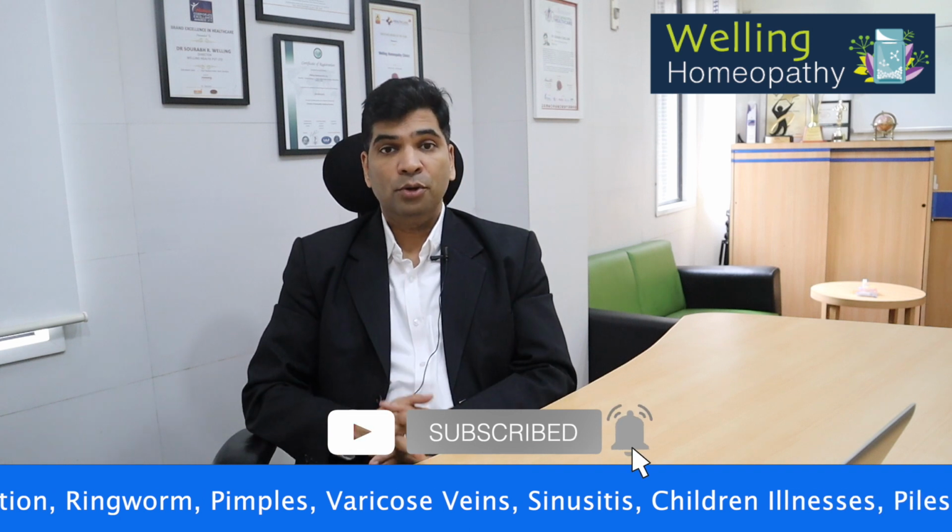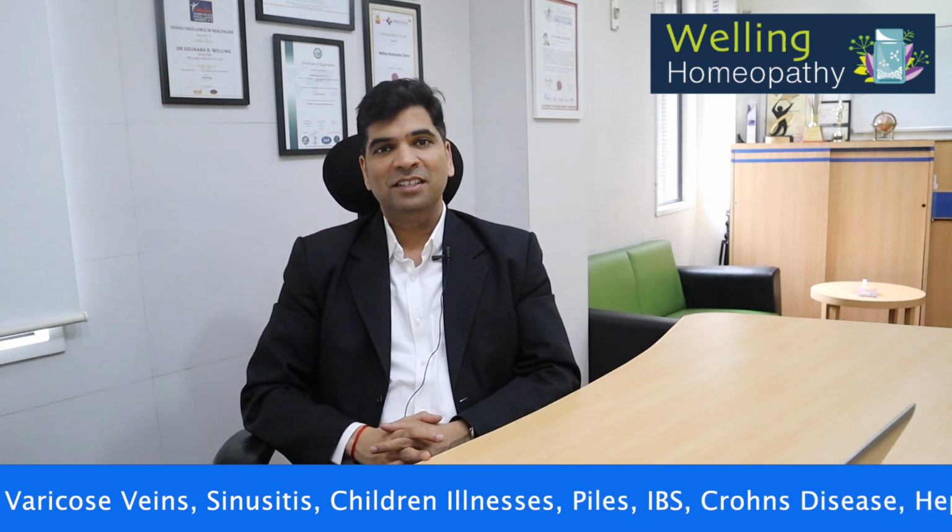Ovulation kits can be used alongside other usual methods of ovulation detection, like you might have heard of basal body temperature or checking the cervical mucus. This can give you more assurance and helps you get to know your body better.